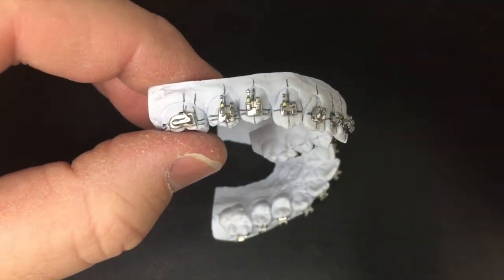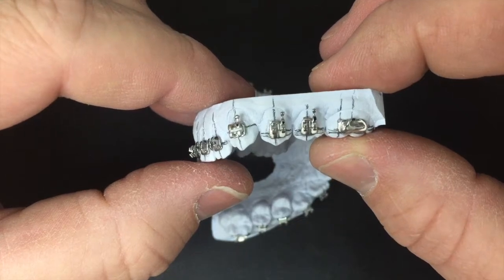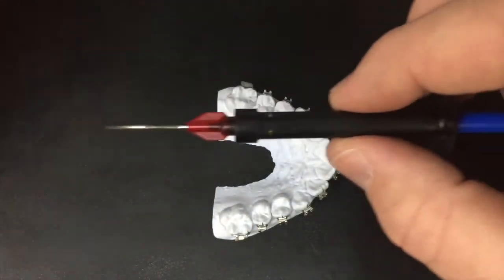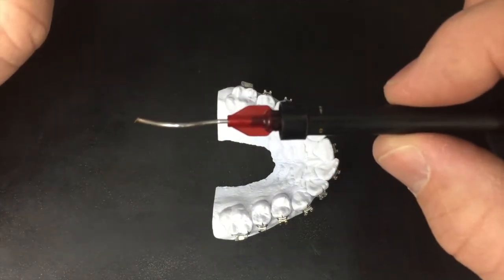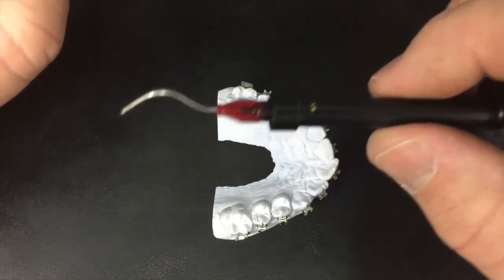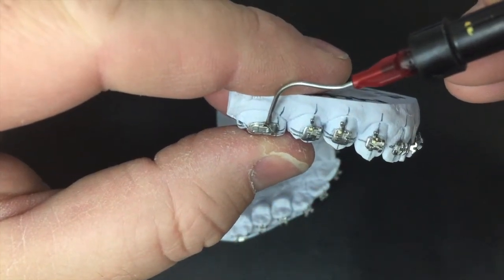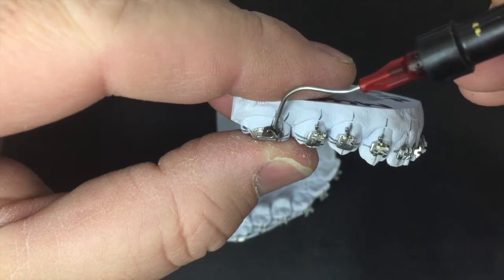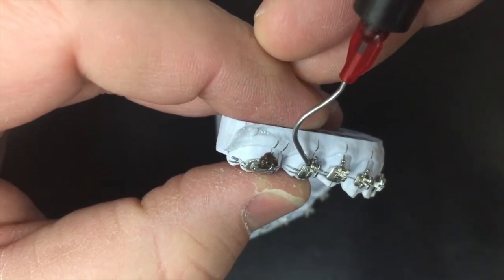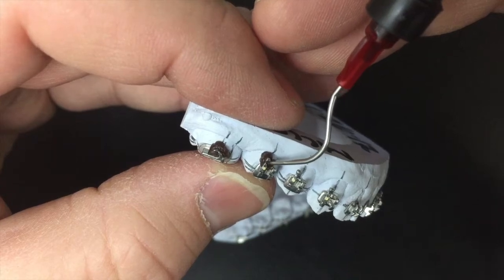So as you can see on this model we actually have these hooks right here. We need to fill those with a block-out that's water soluble. The block-out that we use is actually found in this syringe and it is chocolate frosting from your local grocery store. This is a process I learned from Great Lakes Orthodontics. You put it back there, it'll dry and be hard enough to do the tray, but then you can soak it and the frosting gets soft and washes away. The reason why we do the block-out is the material actually gets encased behind these hooks and you won't be able to get them out.